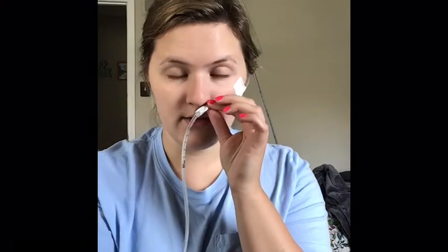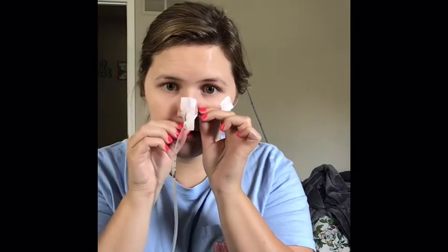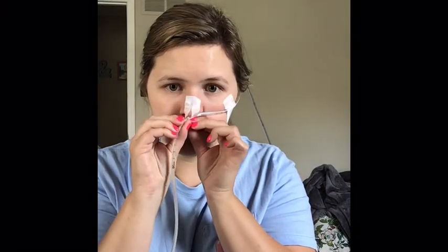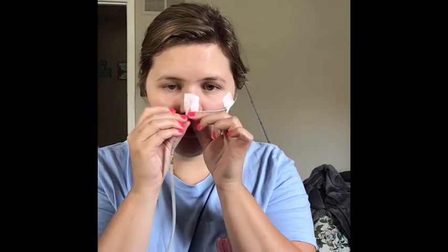So I'm going to get this taped down. You want to tape it well enough that it stays for right now, but honestly, you're going to send your patient for a KUB, but you're probably going to have to move it, to be honest, because I always have to move it when I put mine in. So when you do these little leg things, what you do is you put it on the bridge, and it's really hard to do this on yourself, but you kind of just wrap these around. So the little wings wrap around, and it's easier if it stays in the, oh, well, see that did pretty good. And then usually I just put one across the top right here.